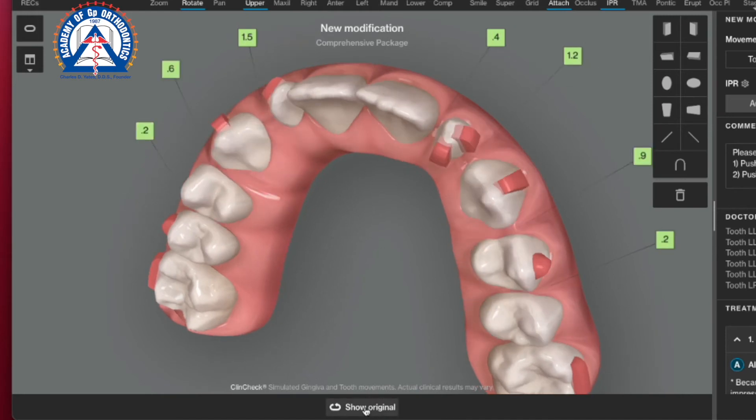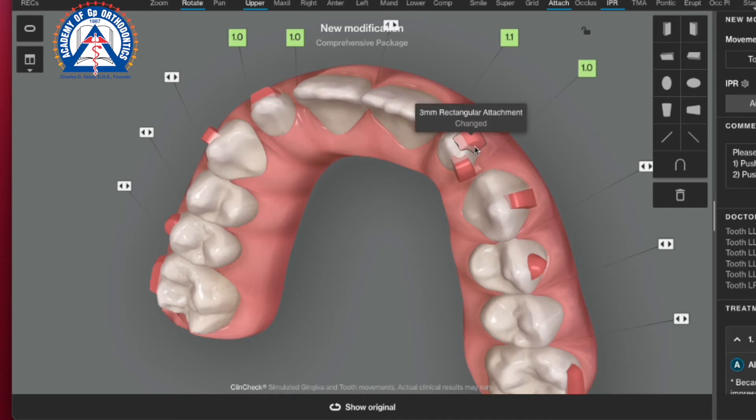My instruction to the assistants would be to overfill the template, as long as I get those nice planes to be able to have the plastic push through. The lingual attachment in this case will work first, and the buccal attachment will work next once it's exposed enough.